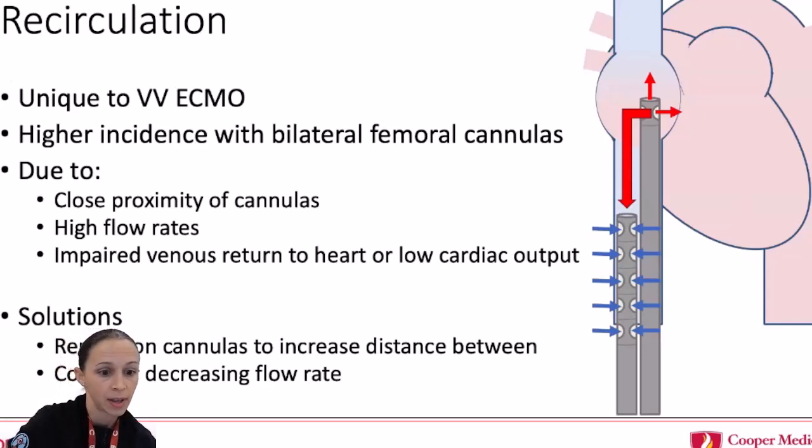Can you think about, if you're looking at the cannulas and looking at the tubing, what would be a clue that you're recirculating? Do you see the sats ever change? The color. So what are you going to see? Darker blood? They're the same. It's more red, right? Because the drainage cannula is stealing the oxygenated blood, so they actually become both bright red.